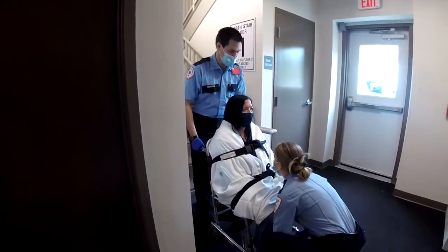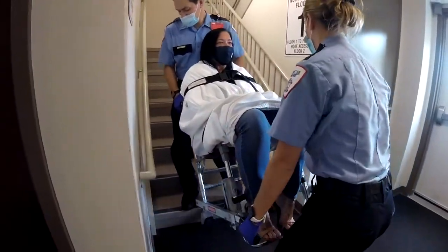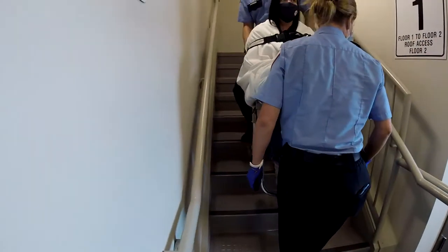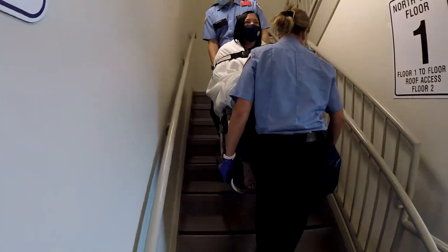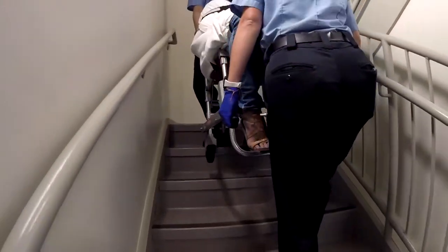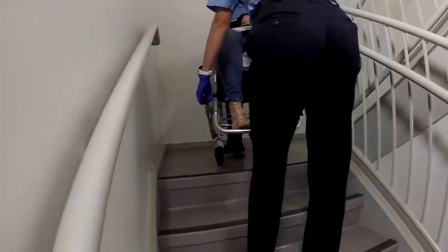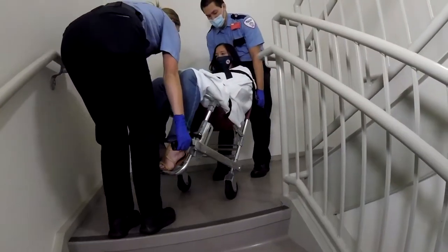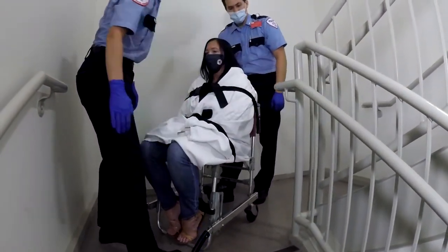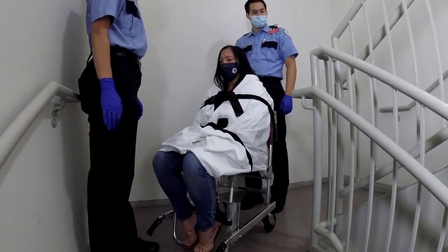When transporting a patient on a stair chair, plan your path of extrication. Team members should walk the path they are going to take with patients in order to mitigate any obstacles that may be in the way. All straps should be secured. Team members should utilize closed loop communication techniques in order to facilitate a smooth transition and prevent any tips from happening. Always be aware of your surroundings, and ensure that the stair chair is properly locked prior to putting a patient on the device.